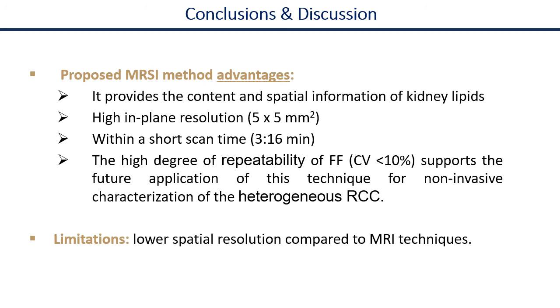It also showed a high degree of reliability, which supports the future application of this technique for non-invasive characterization of heterogeneous RCC. The limitation of this sequence is lower spatial resolution compared to the MRI techniques.